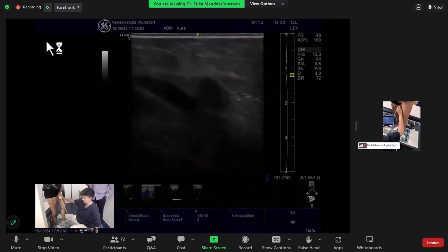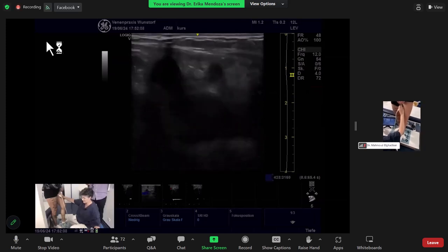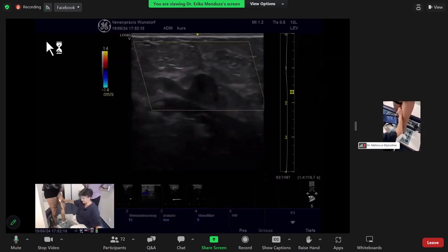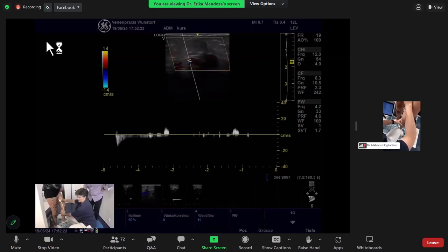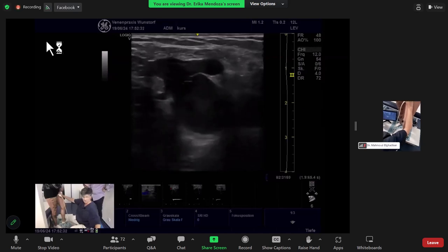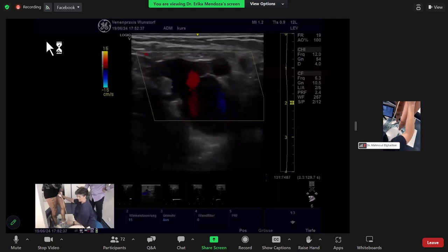Let us also have a look at this posterior accessory. There is none. So this test tells you where the reflux is coming from and how you manipulate your treatment to tackle it without affecting the great saphenous vein. This one is also an incompetent posterior accessory, but I think we have seen most of the reflux after laying down and standing comes from the deep vein, obviously.